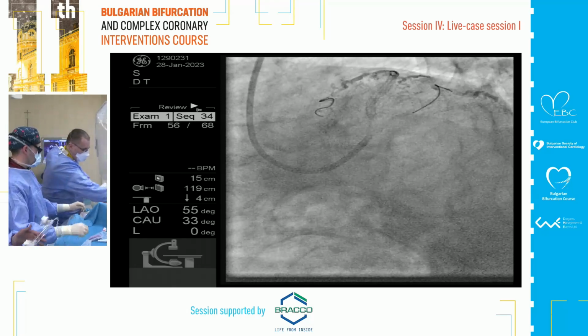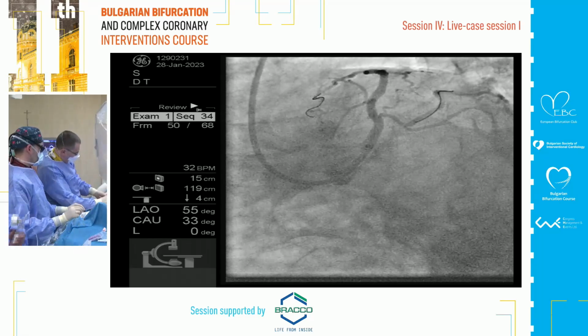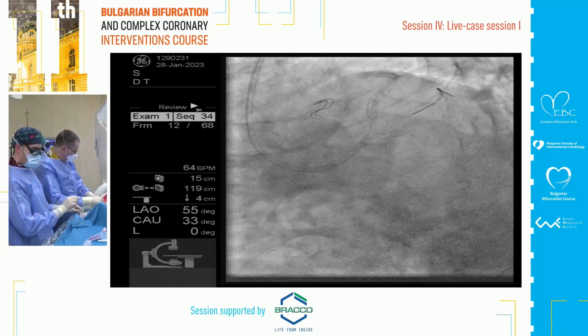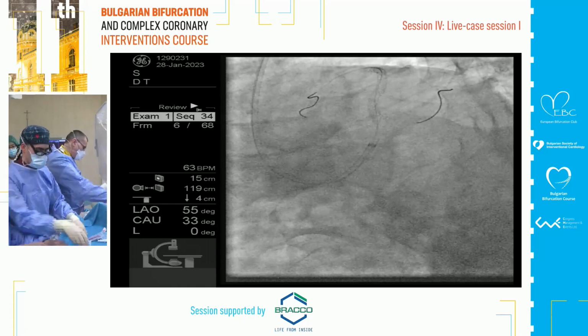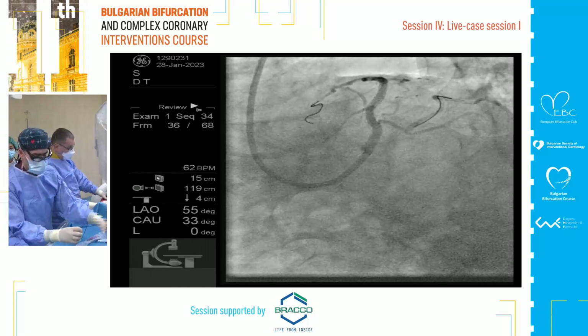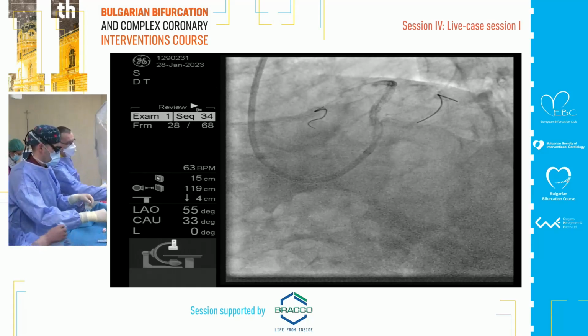But it's crossed over, no? I think it's crossing over. You just stand very delicate, touch the left main. It's fine. It's crossing over a bit. Just a little. We'll see with IVUS. Yeah. Will be interesting to see.